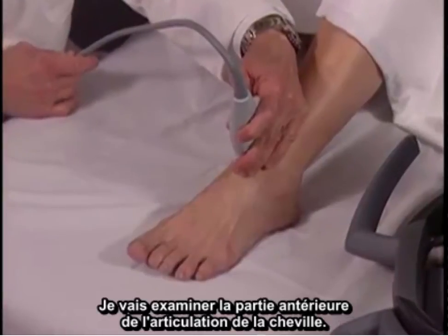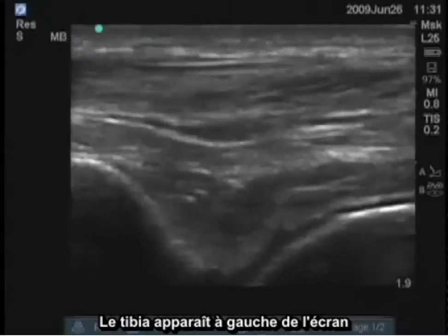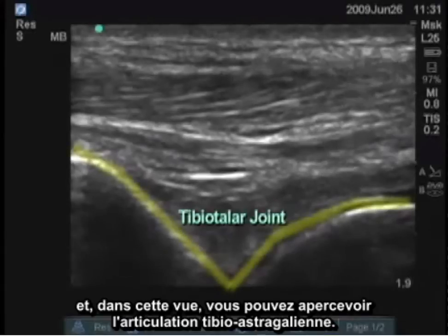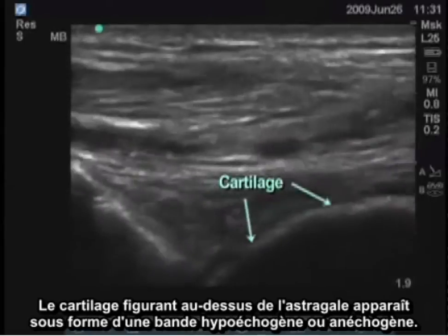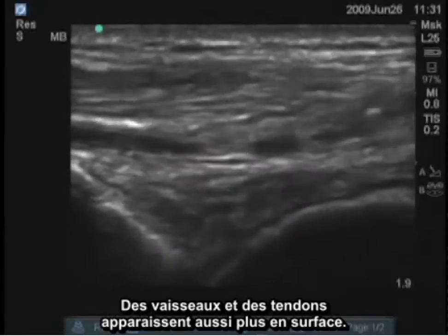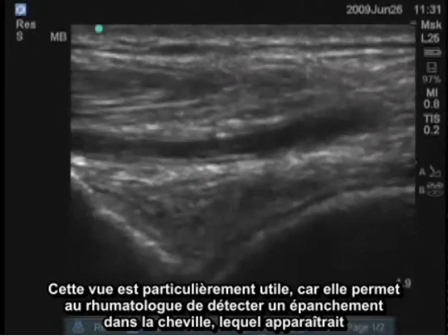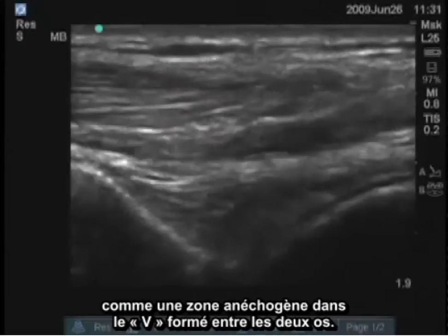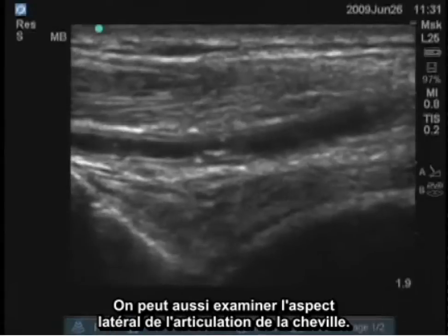I'll examine the anterior portion of the true ankle joint first. On the left side of the screen is the tibia, and in this view you see the tibiotalar joint. There's a hypoechoic or anechoic stripe over the talus, which is cartilage, and there are vessels and tendons superficially. This would be one of the best views for a rheumatologist to find an ankle effusion, which can be seen as an anechoic area in that V between the two bones.